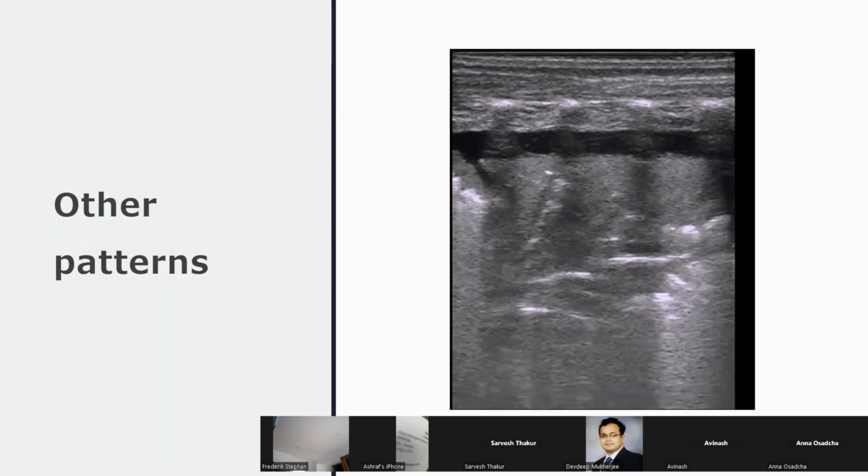So what I'd say is that what is really important is that you know what your baby's prior hemodynamic status is, pulses, blood pressure. So this baby was very septic, and we had quite a labile blood pressure. Now, this is just an example of a scan that I've given you from the net, from Jinglu's work. But if this baby clinically was very septic, then you had a low blood pressure, you'd have to be very cautious because technically an increase in pressure would decrease venous return.